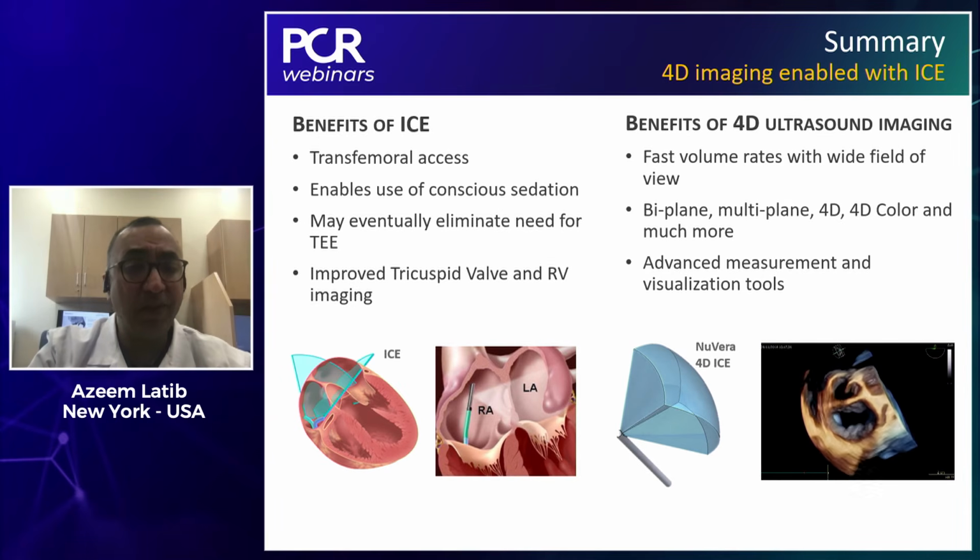But I definitely think within the next few years, we'll see more and more reports of patients being treated on the tricuspid valve in particular, and probably also on the mitral, using only 4D ICE catheters without intubating the patient and doing these under sedation. So I just wanted to give you a flavor of what I think is going to be the future and how we're going to apply 4D ICE catheters in our structural procedures.